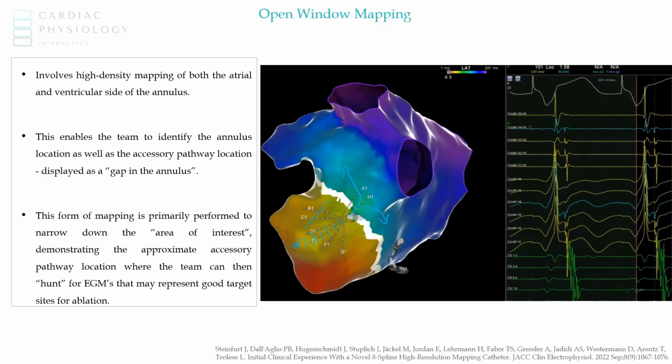Of course, no conduction will cross the actual mitral annulus except through that accessory pathway region, because the mitral annulus is made up of fibrous, electrically inert tissue, so it represents a barrier to conduction. So if we pace from the RV and have conduction going through the accessory pathway like this, and then we take a data point here, we place a catheter in this location, and we measure how long it takes from the pacing spike to the EGM that we see here.